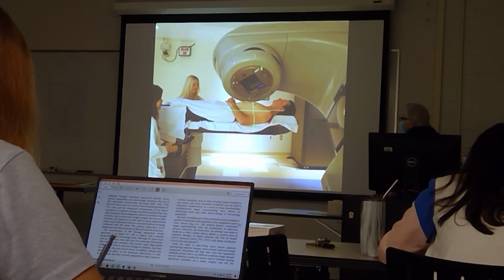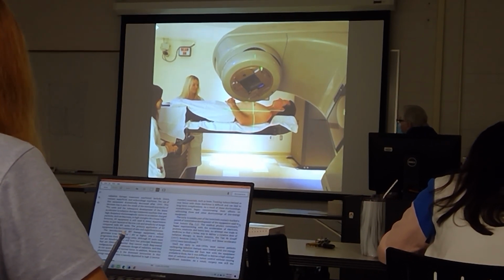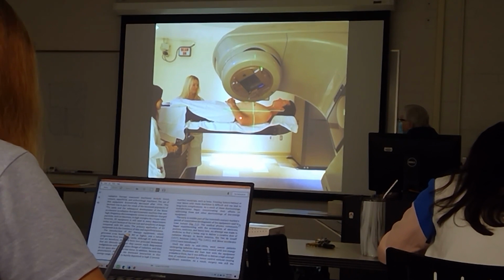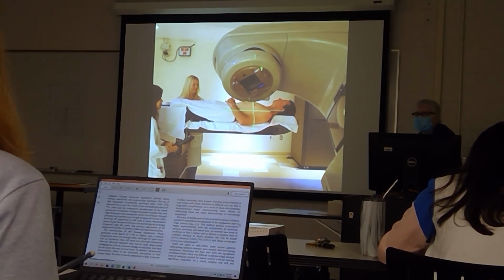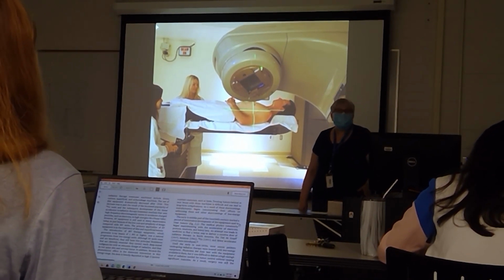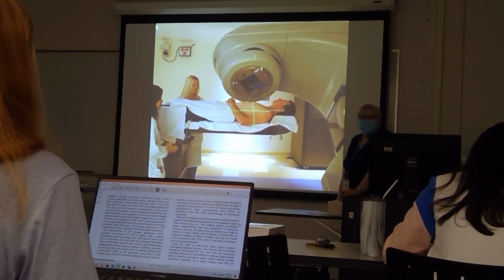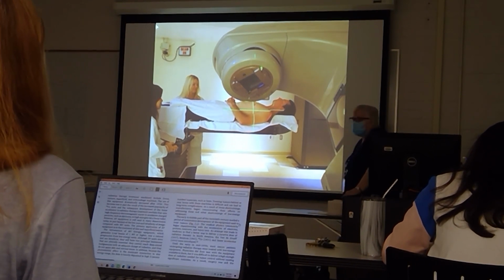So here we are again, your laser lights. There's a red one here. Can anybody tell me what that is? It's a trick question. I don't expect you to know what it is because it's something that doesn't exist anymore. It's a back pointer.